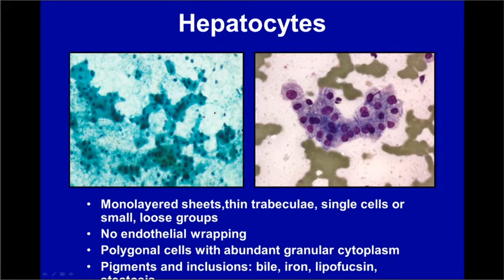These images demonstrate what normal hepatocytes look like. Typically, they occur in trabeculae that are 1 or 2 cells thick, as we see here. Here's a single cell trabeculae. They have abundant, granular, well-defined cytoplasm and centrally located nuclei. We can see them here on DiffQuick with well-defined cytoplasm. It looks a little bit more granular or vacuolated, and we see the nice round centrally located nuclei.